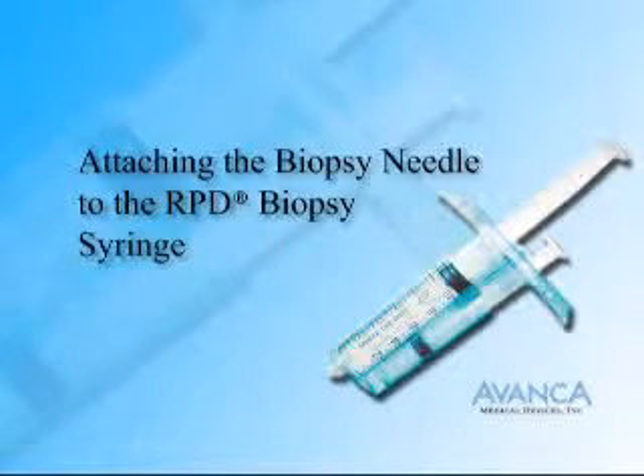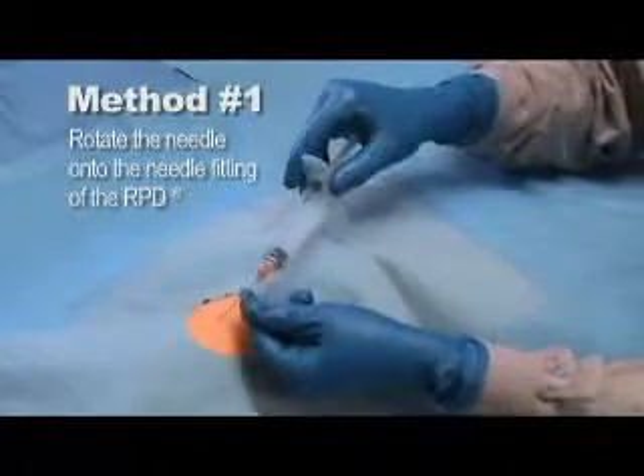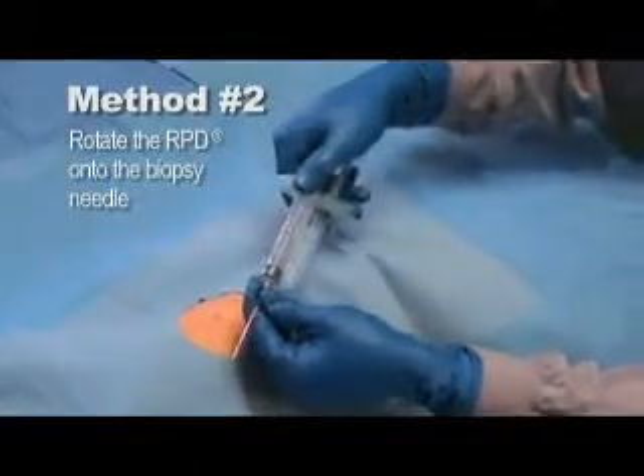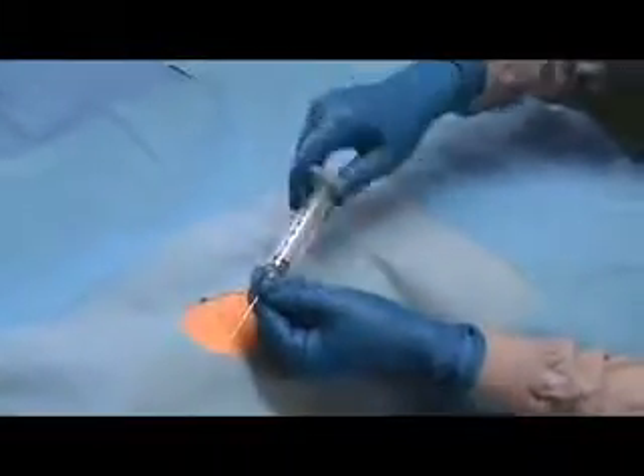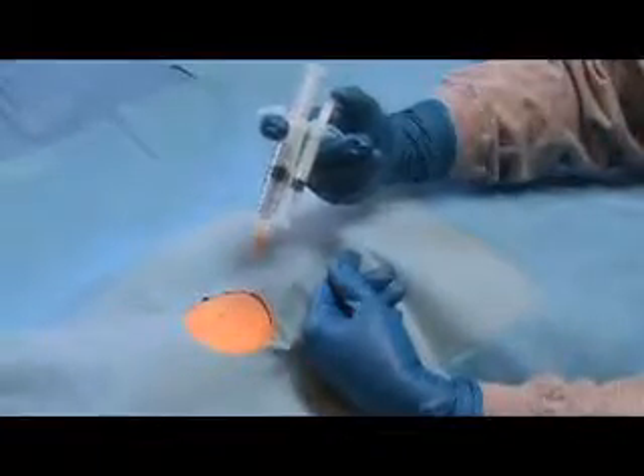Attaching the Biopsy Needle to the RPD Biopsy Syringe. Attach the desired biopsy needle to the needle fitting. The first method is to rotate the needle onto the needle fitting of the RPD. The second method is to rotate the RPD onto the biopsy needle. The needle fitting of the RPD has a safety anti-stripping mechanism that helps prevent over-tightening of the needle while maintaining an airtight seal.